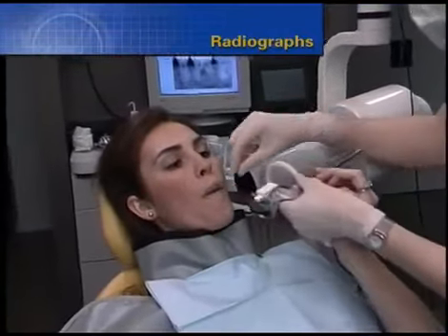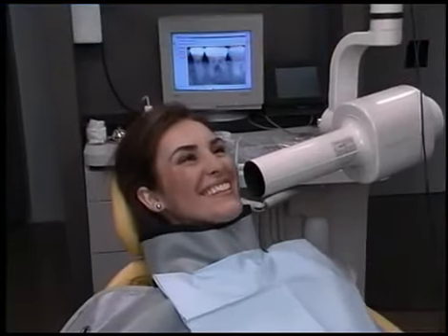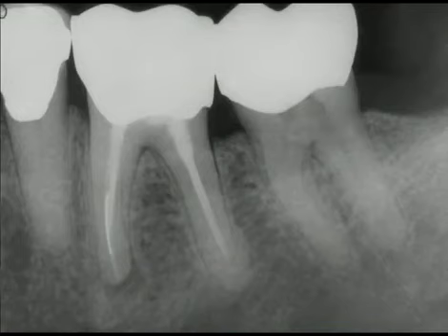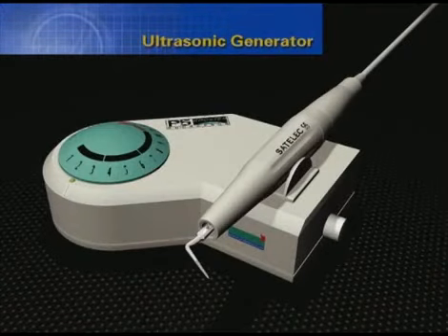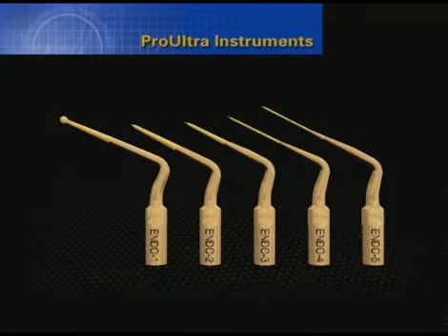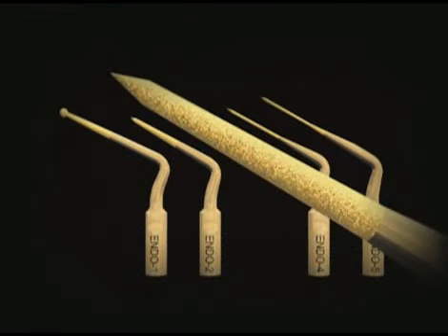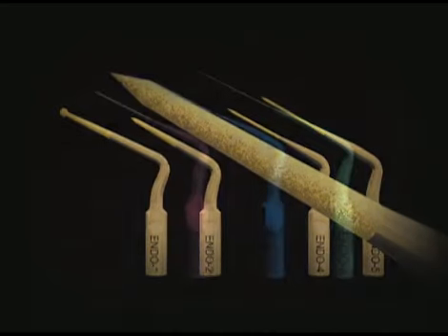Once again, clinicians should take 3 well-angulated radiographs prior to initiating treatment. Specifically, in broken instrument removal, this allows for better appreciation of the cross-sectional diameter, length, and curvature of the canal, root morphology, and the overall position of the obstruction. Ultrasonics will be your best friend when dealing with a broken instrument. We've discussed the ability to precisely sand away dentin in a controlled manner with these instruments. You will see this advantage demonstrated in broken instrument removal exercises.